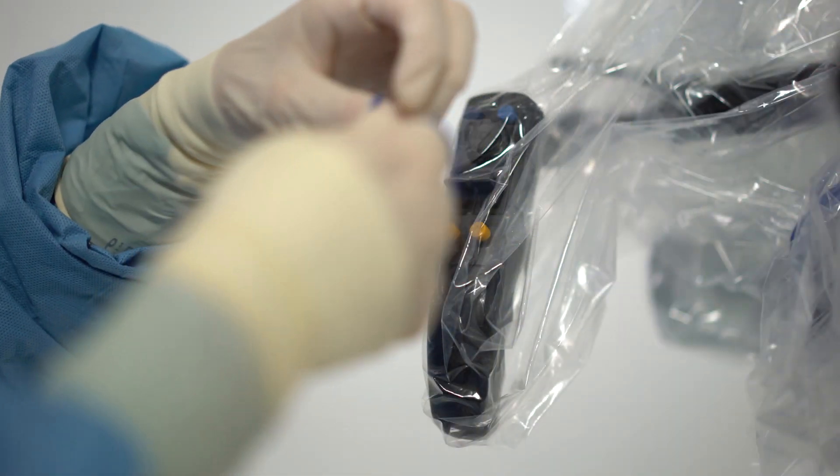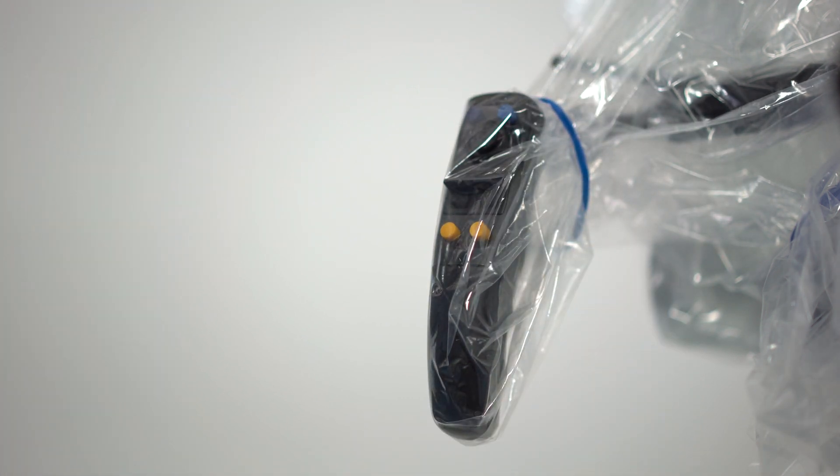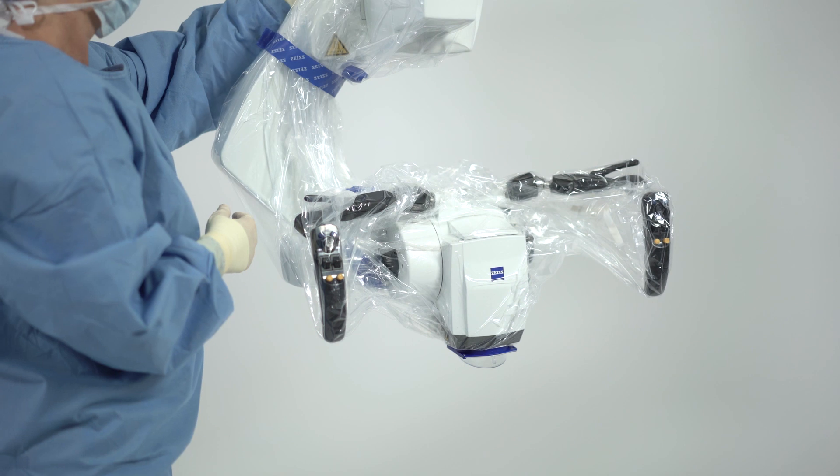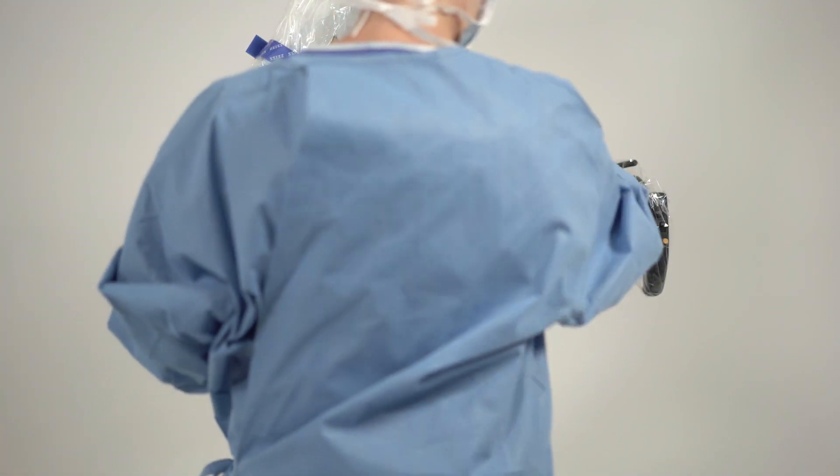Optionally, use the blue elastics to secure excess drape around the hand grips or other areas of the device. Make sure to not tighten the drape too much in order to avoid tension of the drape or blocking the rotations or switches of the device.